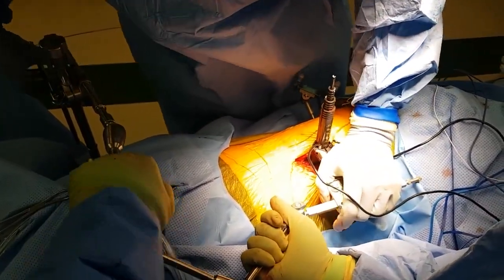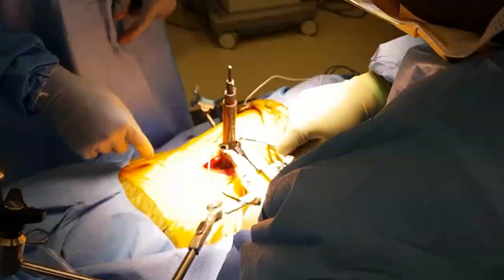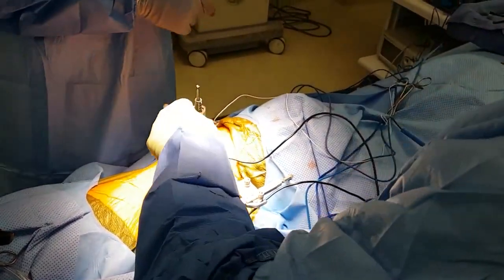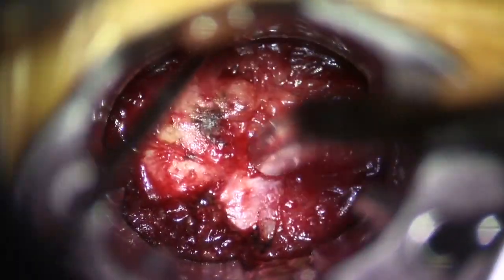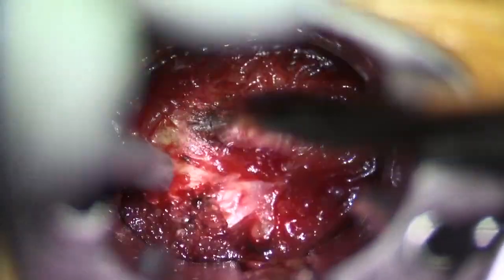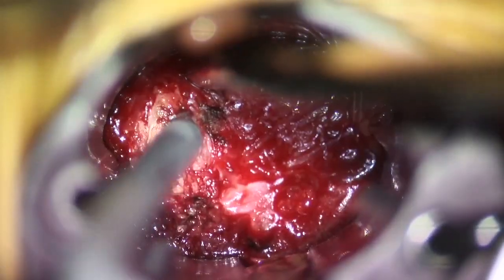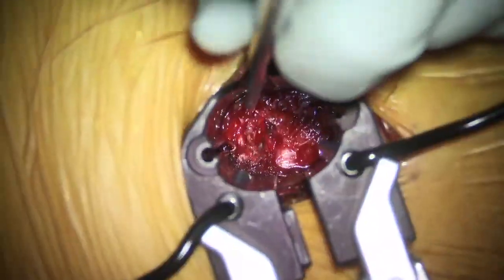You can use the dilation tubes to place your retractor system. This retractor system is not a typical Medtronic OLIF retractor — it is a different system. Once it is in place, you need to be very precise and everything has to be aligned. Open up the retractors, identify the disc space, and we do not put any pins into the vertebral body to hold them retracted.